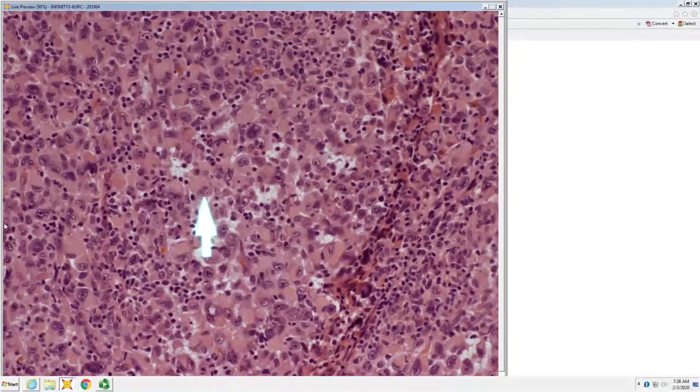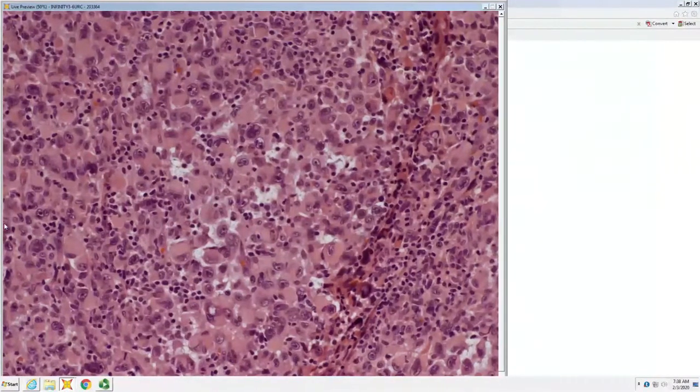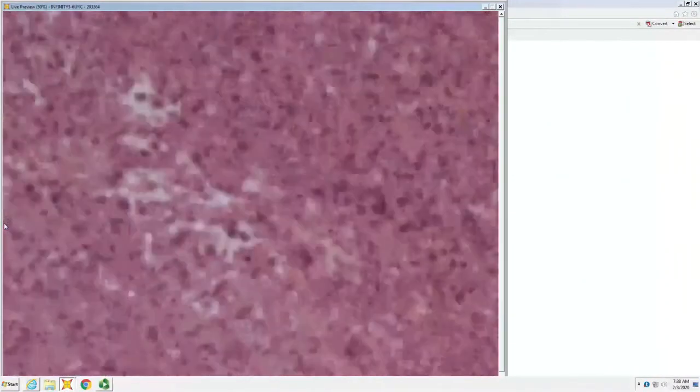Is it vesicular, or no? Oh, vesicular. So, rhabdoid. That's a useful term. A rhabdomyoblast, like what you'd see in rhabdomyosarcoma, has a big pink blob in the cytoplasm and then an eccentric nucleus. So these are all rhabdoid cells.